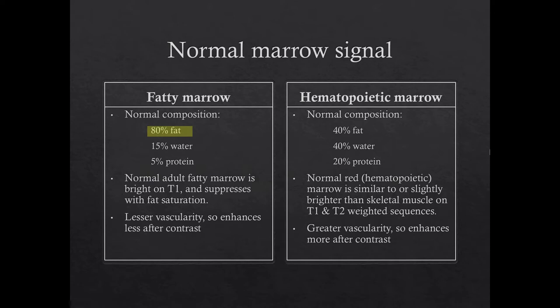Normal hematopoietic marrow has less fat, approximately 40%. Because of its higher water content, it is therefore darker on T1 and higher in signal on T2. A good internal reference is the skeletal muscle. Hematopoietic marrow should be similar to or slightly greater in signal to the skeletal muscle on T1-weighted sequences. It will also be slightly greater than skeletal muscle on T2-weighted sequences, but should not be dramatically greater in signal. It also has more vascularity and enhances more after contrast.